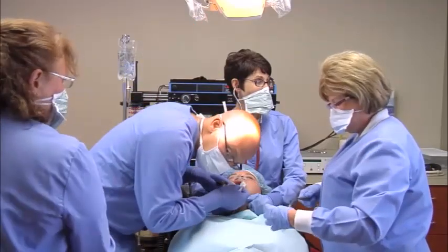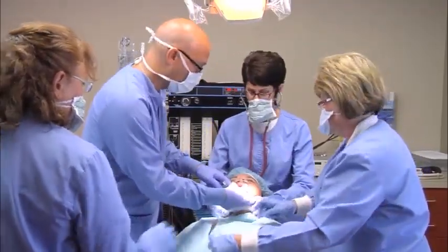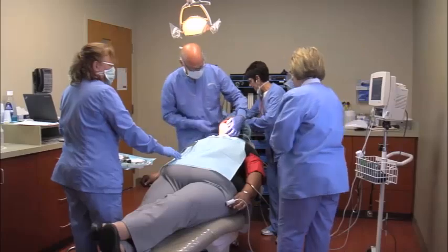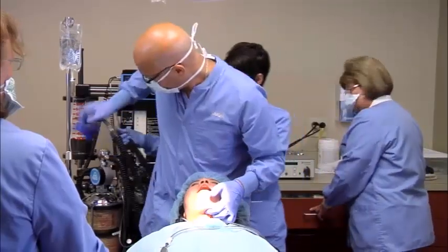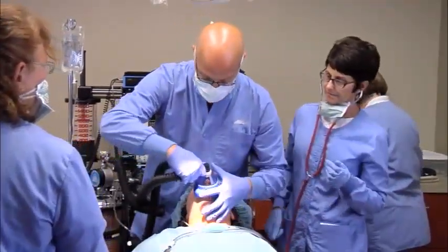89, 86. I don't hear any breath sounds. Okay, let's go ahead and switch over to a full face mask. The tongue is protruded by means of traction, but this maneuver does not resolve the airway obstruction. Continued airway obstruction, despite these maneuvers, usually requires the use of mechanical airway opening devices. Positive pressure ventilation with a bag mask device is deployed.